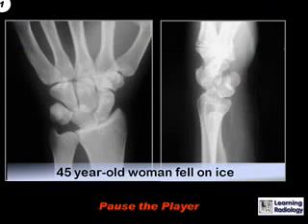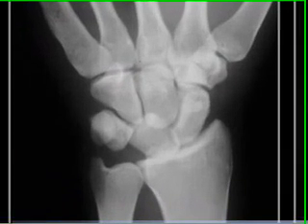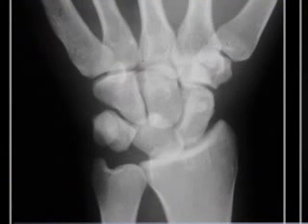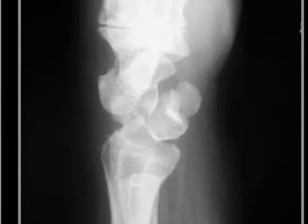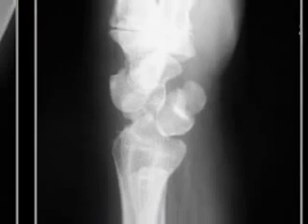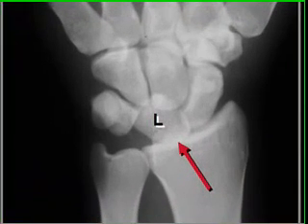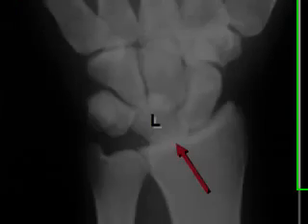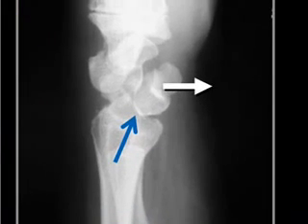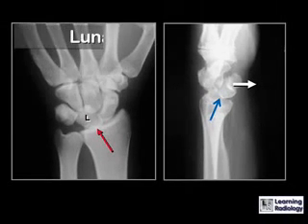The first case is a 45-year-old woman who fell on the ice. If you noticed that the lunate in the frontal projection had a triangular rather than a quadrilateral shape, and in the lateral projection the lunate was dislocated in a volar position and no longer articulated with the radius (the blue arrow), then you would have seen that this is a lunate dislocation.